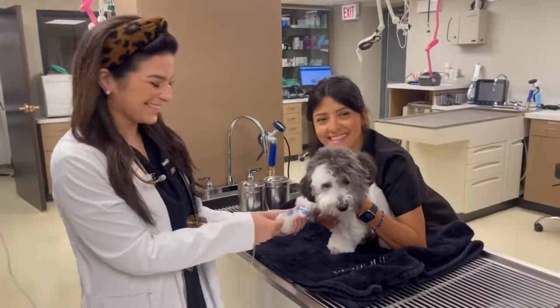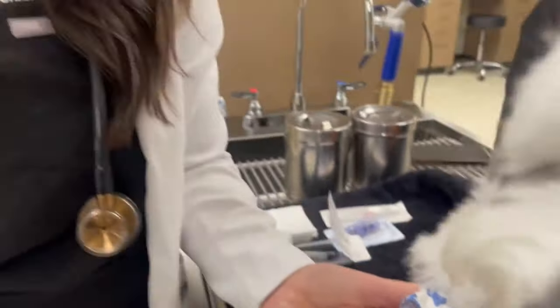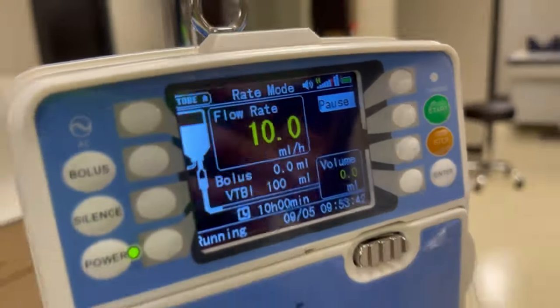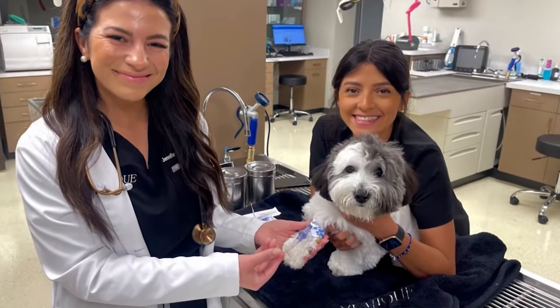When separation does occur, the Break-Free IV Set allows veterinary professionals to restart infusion in seconds without having to replace the catheter, administration tubing, or medication. This significantly reduces downtime during treatment. I think that's a win-win for everybody.